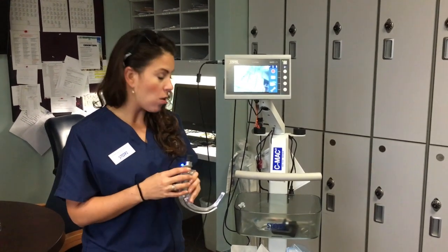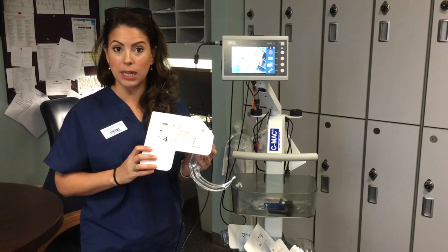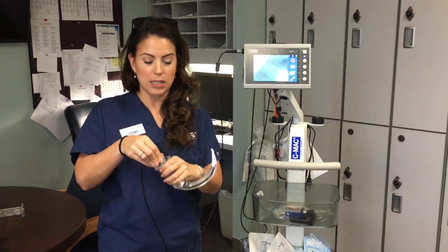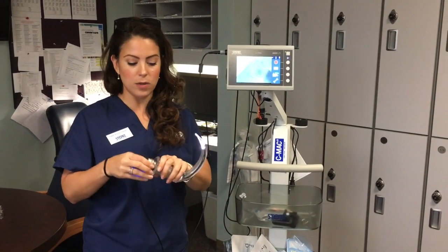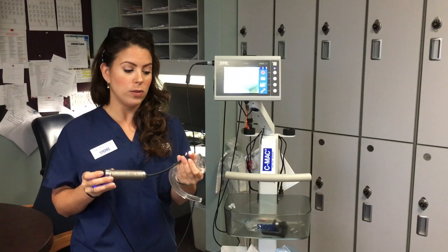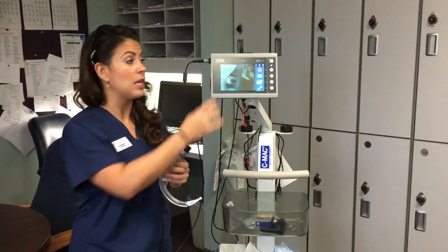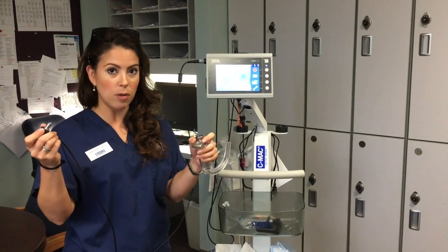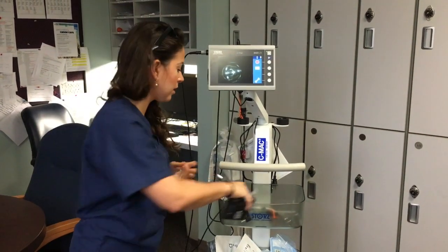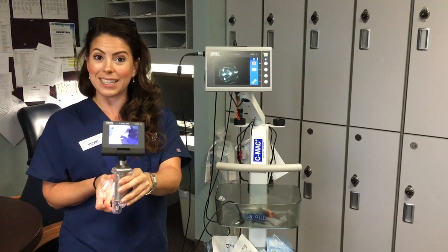These blades are disposable. All your supplies will be in the bottom bin, and blades are labeled MAC 3, MAC 4, or D for the hyper-angulated D blade. Peel the packaging open, your blade is inside, slide it on, and you're ready to intubate. After intubating, throw the plastic away, save the handle, and wipe it down with an orange or green Sani wipe. Use an alcohol swab for the tip since that's the camera lens. If you prefer the pocket monitor over the larger monitor, everything is transferable and interchangeable — just pull the cable off, no twisting, attach the pocket monitor, and your blade is ready for ultimate portability.